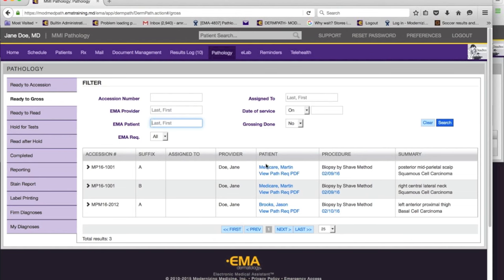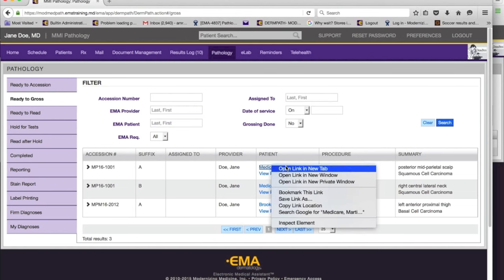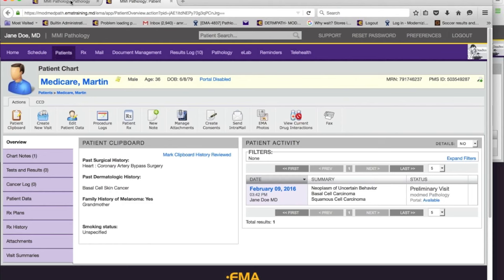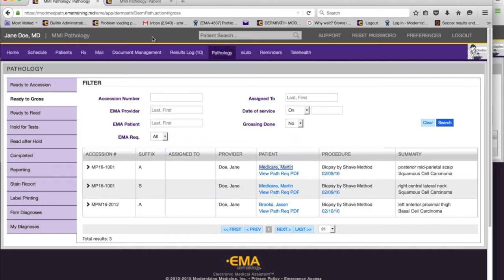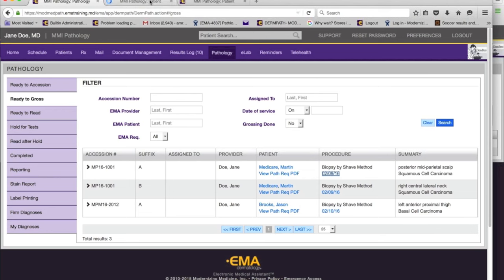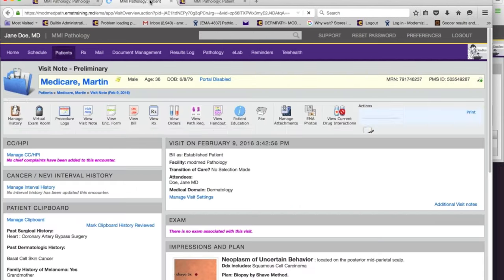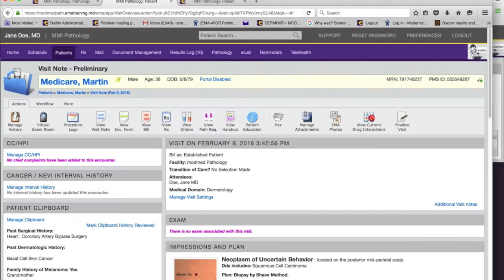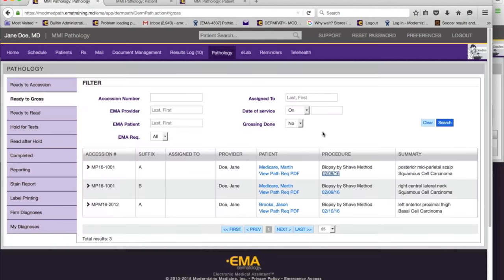To re-emphasize the integration: at any time I can go and see the patient chart, and at any time I can see the specific visit where the biopsy was done. All of this is available at your fingertips. Here is the requisition I showed you before.